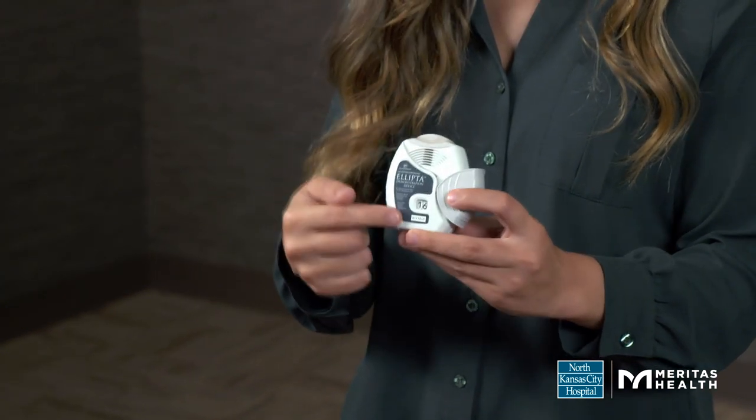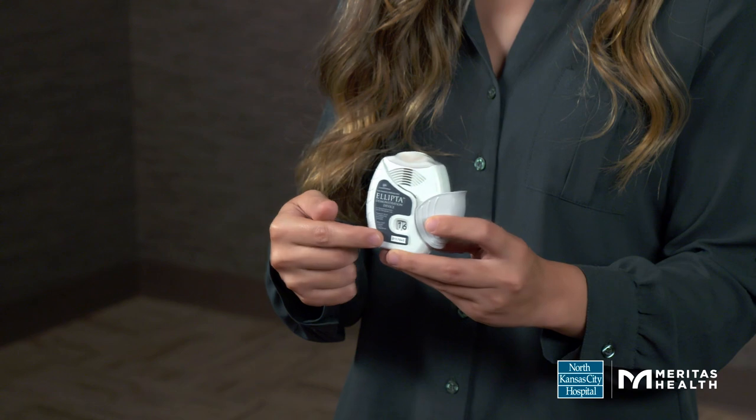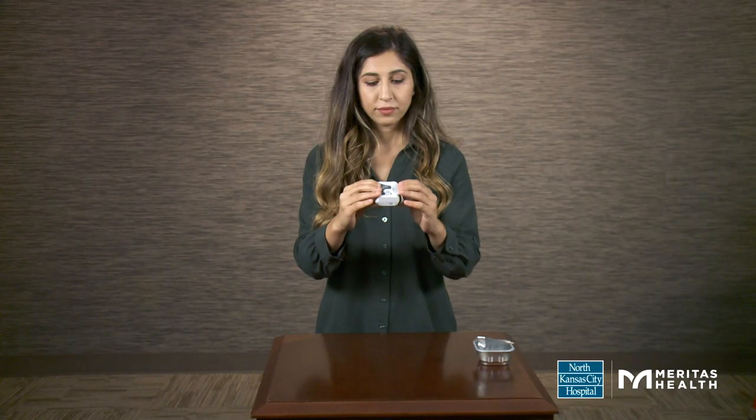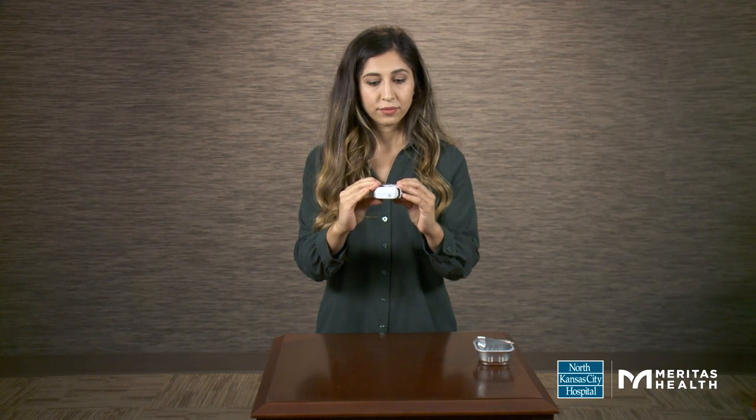At this point, your dose is ready and the counter will decrease by one. Ensuring not to cover the air vents with your fingers, hold the inhaler horizontally like a hamburger.